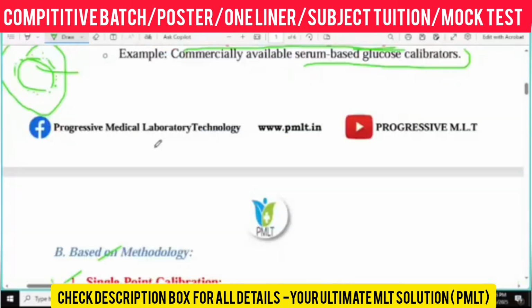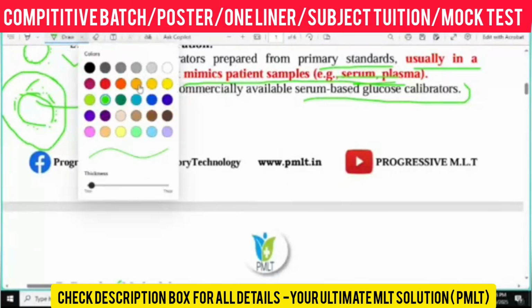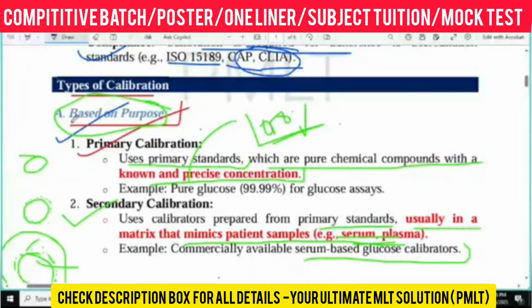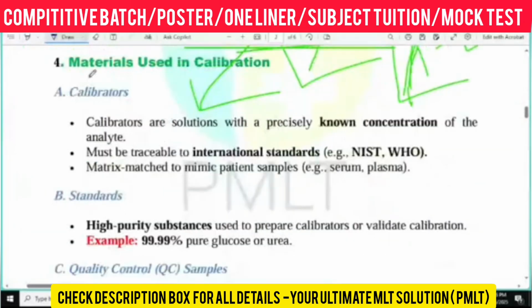So we have understood the types of calibration, right? We have already understood what calibration is. We have understood the types of calibration, based on methodology and based on the purpose of calibration. Now we are coming to the materials used in calibration. Now we have to understand what materials are basically used for calibration.